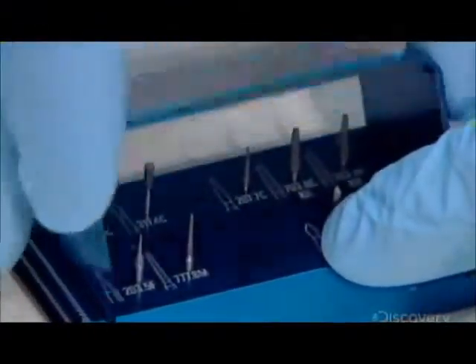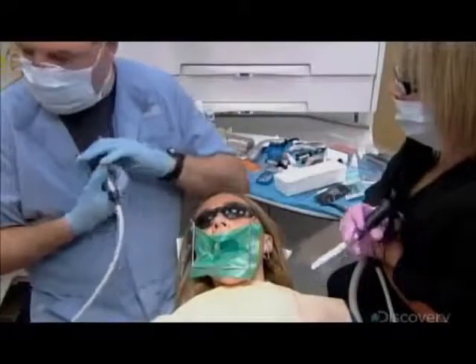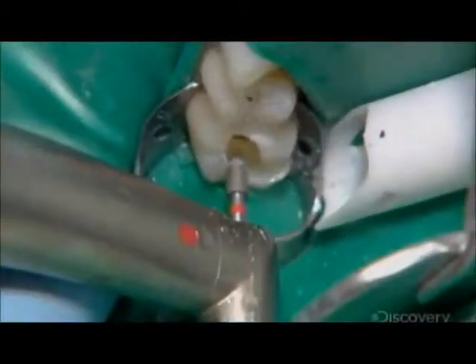He switches to a smaller bit to excavate the remaining filling particles and to remove decay. Each cavity must be completely clear before the restorative work can begin.